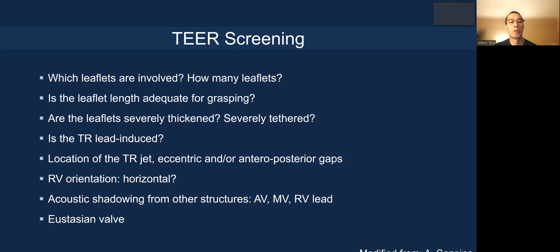How horizontal is the right ventricle? Is there acoustic shadowing from other structures such as the aortic valve, mitral valve, or right ventricular lead? And finally, the prominence and presence of the Eustachian valve.